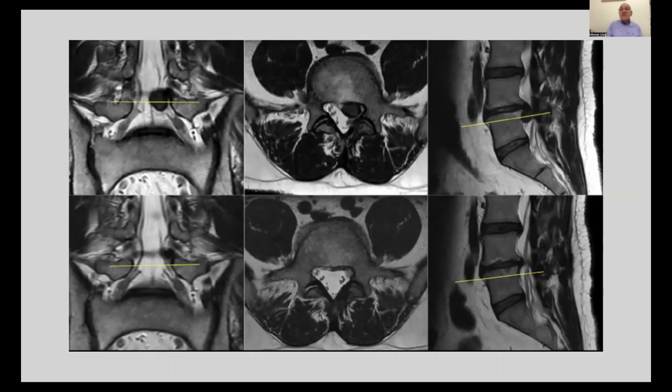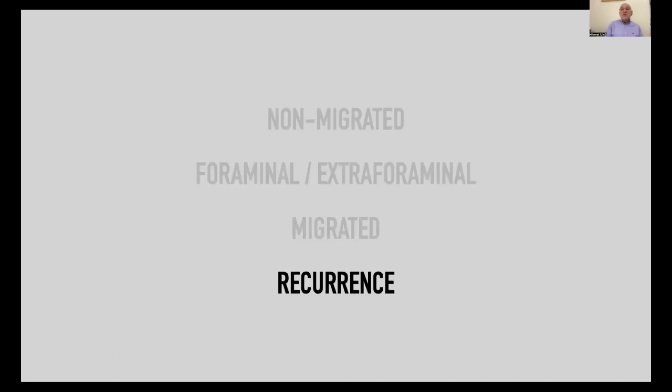So finally, in transforaminal surgery, we change the trajectory. Here, in the interlaminar system, we move within the canal without bone removal or with minimal bone resection, of course. Same philosophy, different working volumes. And the last group, recurrence. With recurrence, we are no longer dealing with native anatomy.